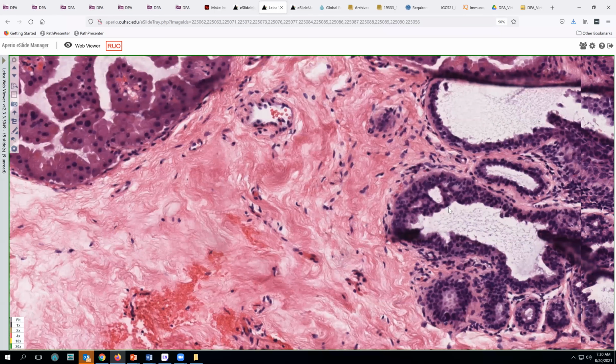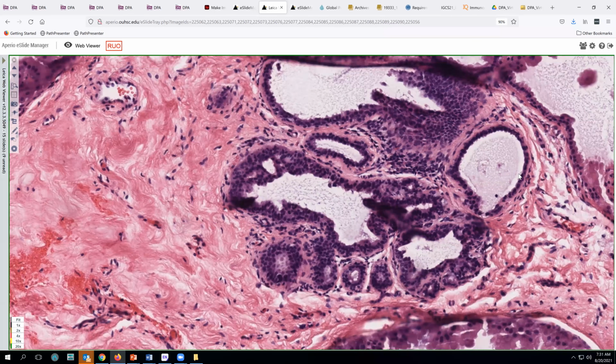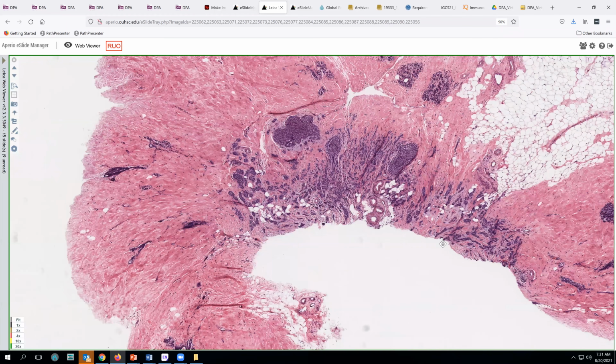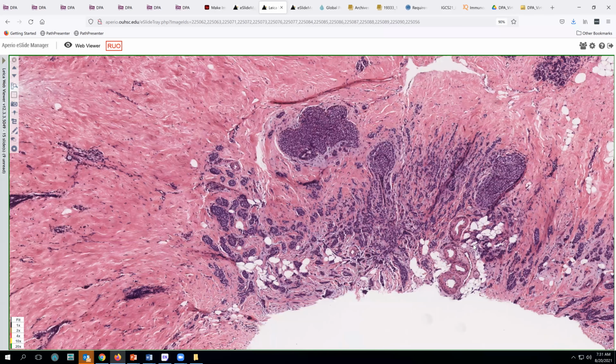Here we have a little bit of hyperplasia, a little bit of sieve-like changes and so forth, but benign ducts and glands there. So we'll go up here to this other area, and this is the obvious carcinoma, I guess you'd say, based on the coloration. So I've selected a number of cases. Actually, these are all cases that came in on one day, just to give you an example of one day's breast service.